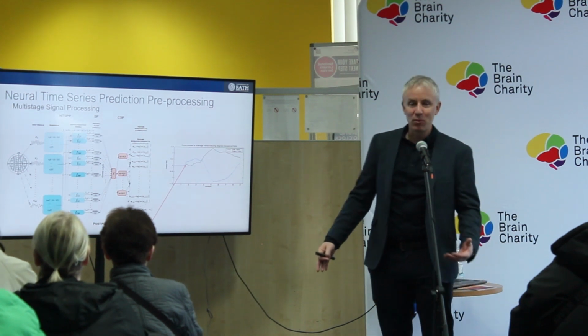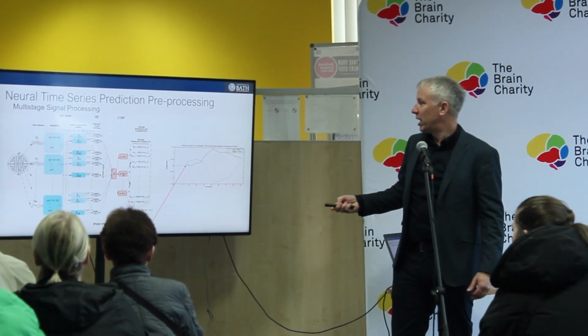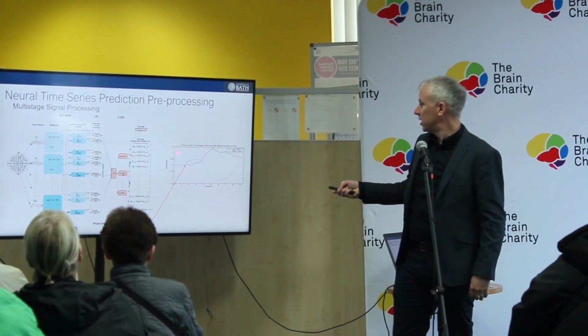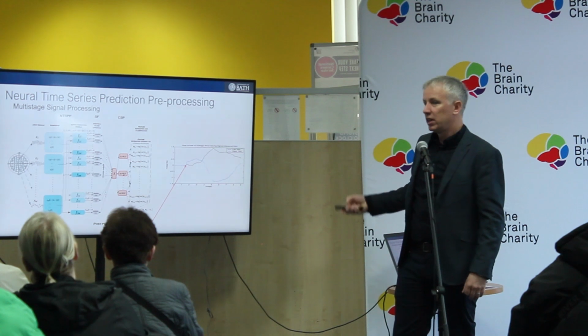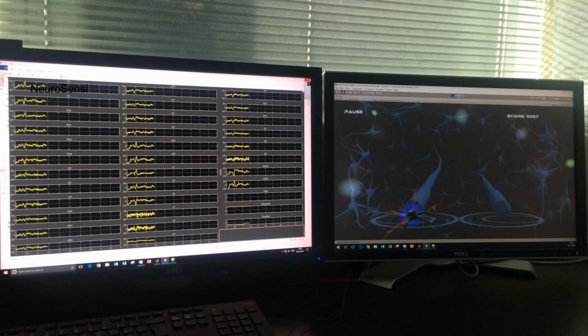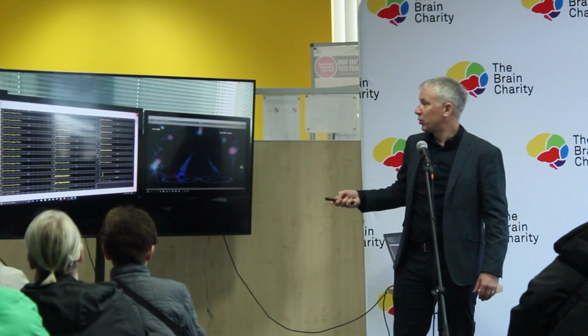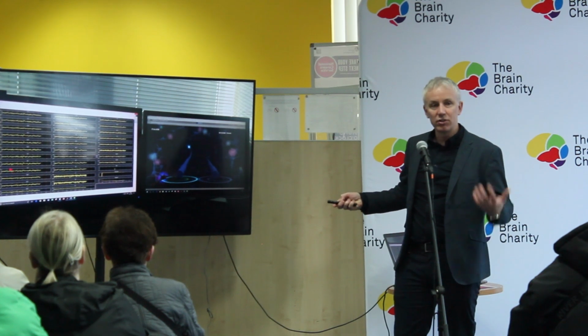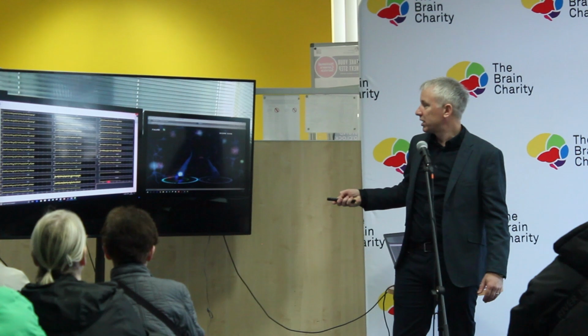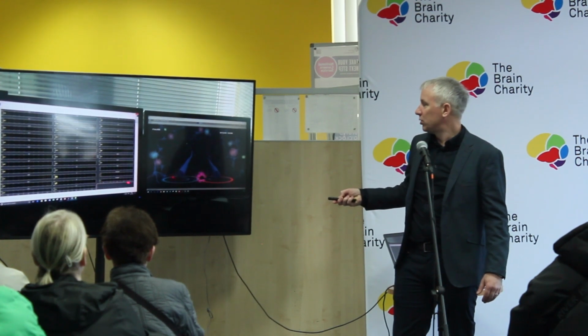But basically what we have is, whenever we imagine movement, we get a signal that goes up like this for left arm movement and down like this for right arm movement. And that normally happens over a 2 to 3 second period. This is an example of a brain-computer interface in action. Here we've got 32 channels of the squiggly signals, the EEG, electroencephalogram, your brain waves. And this is the control signal here going from -1 to 1.